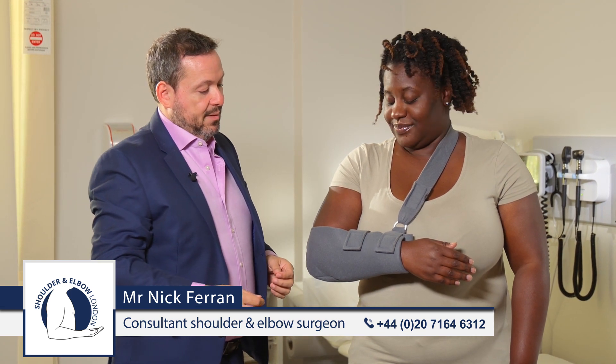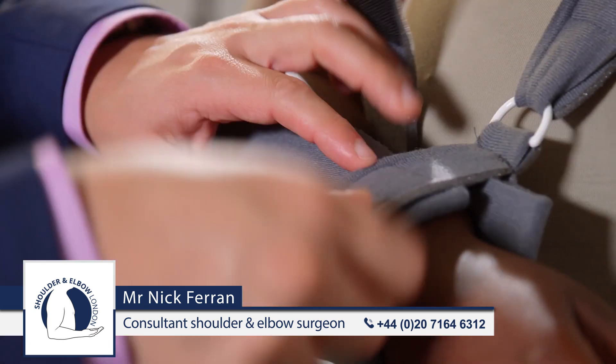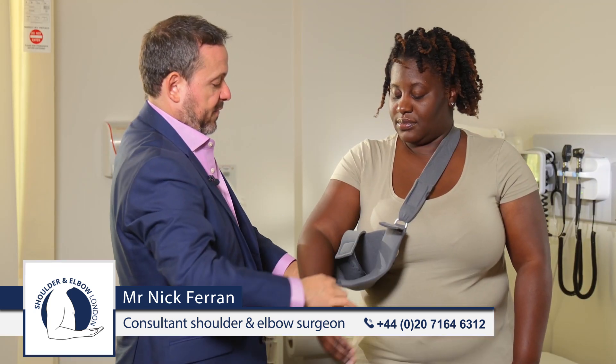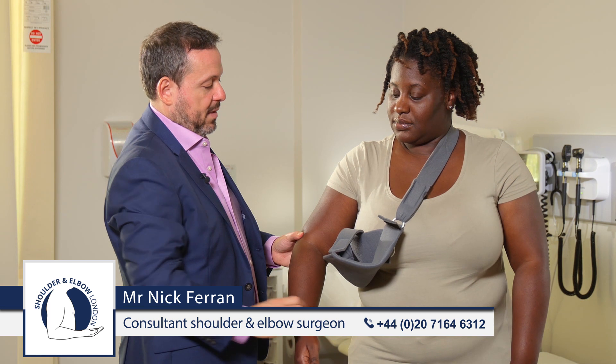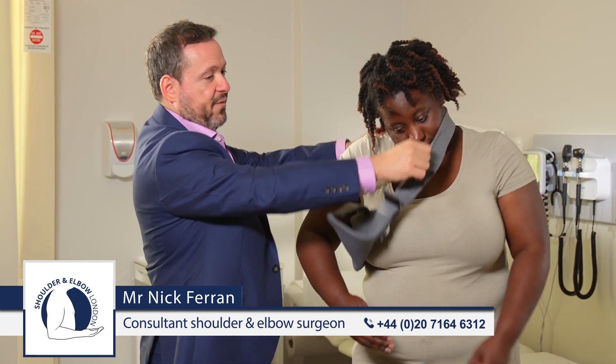When you need to remove the sling, it's simple — you just undo these two straps and the arm can be removed for exercising. If the sling needs to come off for the shower, it can then come off over the head.